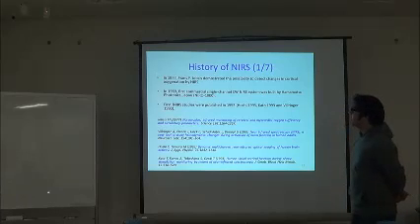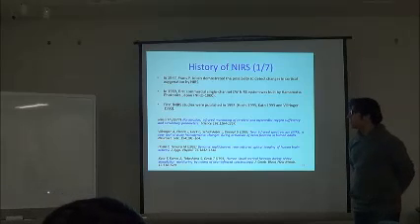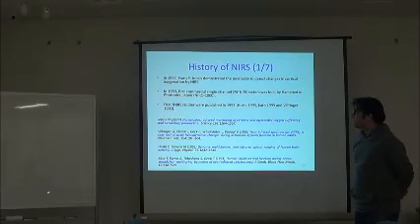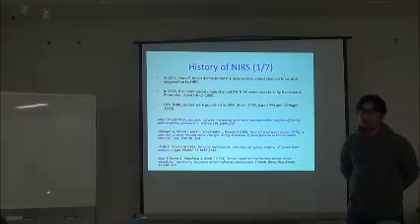In 1989, the first commercial single-channel continuous wave NIRS system was built by Hamamatsu Photonics, a Japanese company, and its name was NIRO 1000. While the first fNIRS studies were published in 1993 by 3 people.